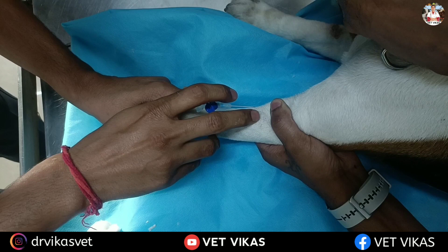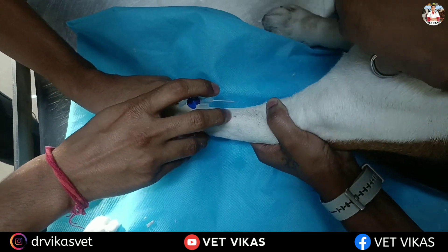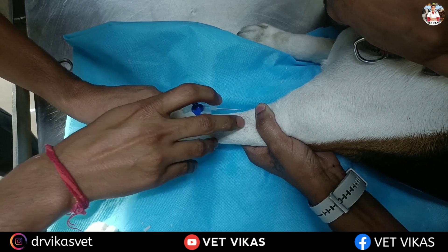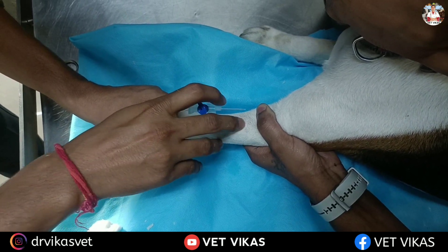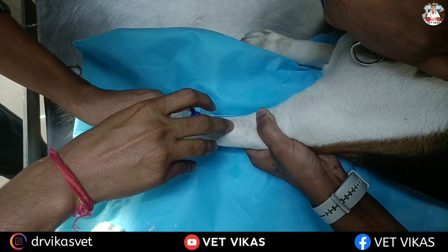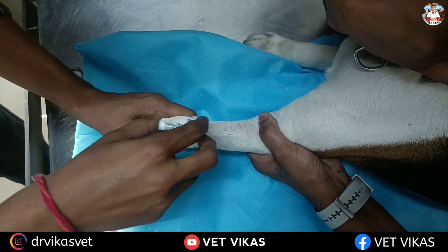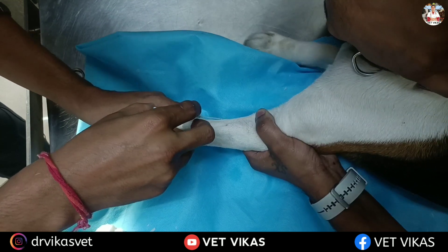Now you have to feel the vein using your finger — it will feel like a tense cord under the skin. Once you feel more comfortable and are confident enough, you can start the procedure.